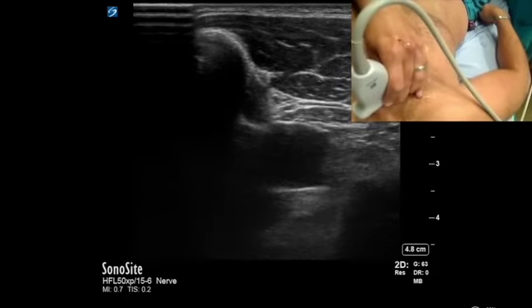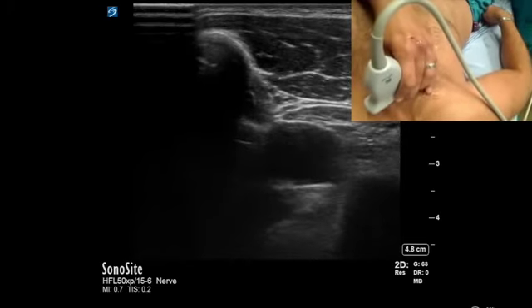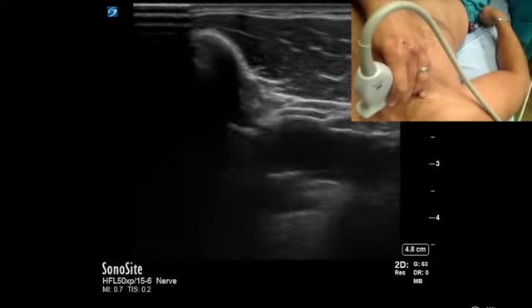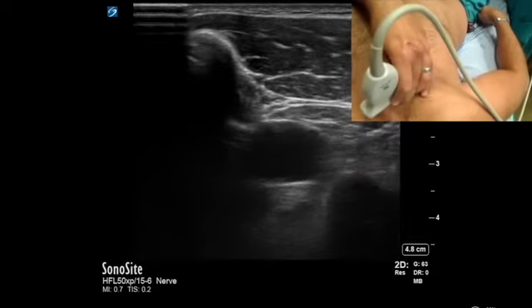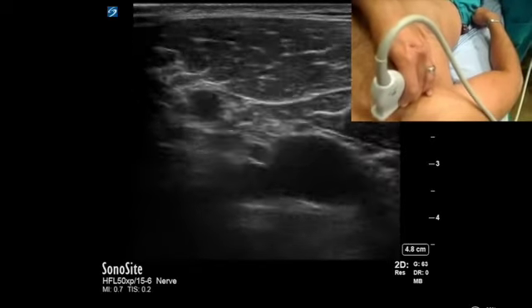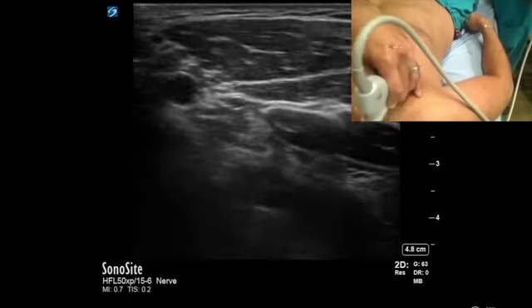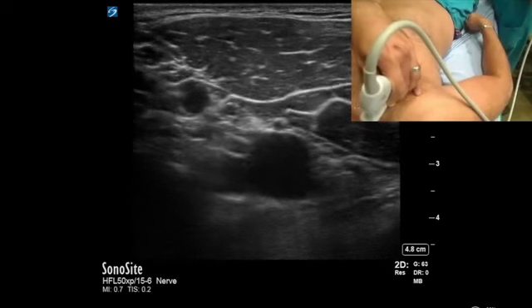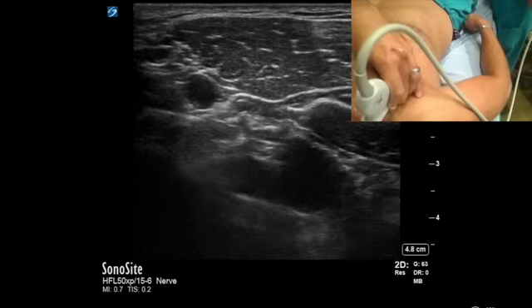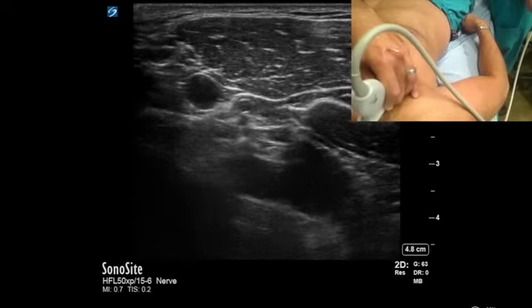One of the benefits of ultrasound, as we talked about in the didactic portion of this, is that you're now able to potentially access the subclavian vein much more laterally, even perhaps at the level of the axillary vein. And so I'll demonstrate that. We're just going to slide our ultrasound probe with the subclavian vein in view and slide more laterally to the point where we're able to identify the venous structure in a much more lateral approach. This is really one of the benefits of point-of-care ultrasound when it comes to subclavian venous access, is that it allows us to potentially go into an area where we're now far away from the lung fields and make the access site of the subclavian vein potentially much safer, at least from the point of potentially causing a pneumothorax.